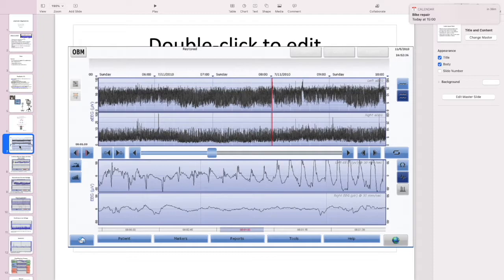We've got reference ranges for normal values for neonates up to about 3.5 months of age, but we don't really know what the healthy child population's background aEEG is, or even for that matter adults. However, the classification system that was designed for neonates is still used in research and is still used to classify adult intensive care and pediatric intensive care.